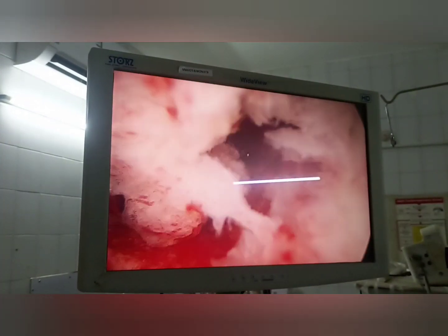Then with the help of graspers, one part of the polyp is grasped and pushed towards the fundus, which will detach it from its attachment, and then it is gently brought out.